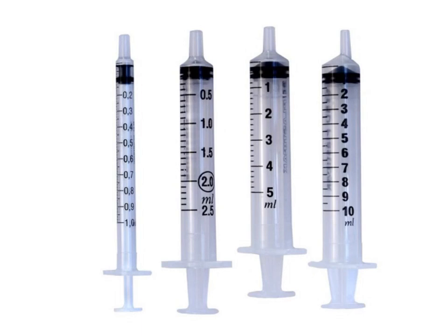So we want to know how to read the different increments on the sides of the syringes. Looking at the screen that you guys have here, you can see there's a couple different types of syringes. You can see that there is a stopper in there that will allow you to draw the medication.